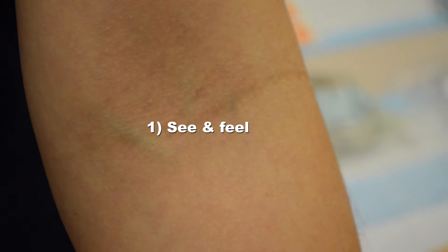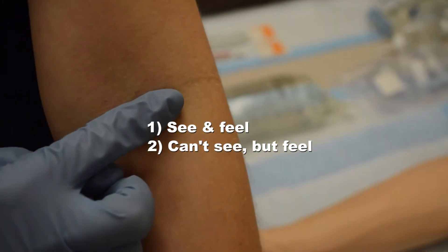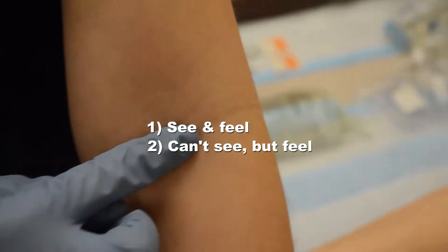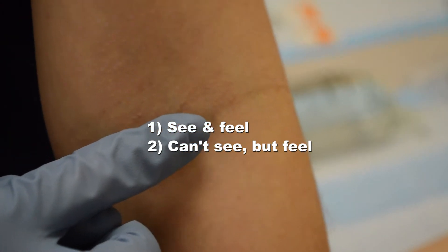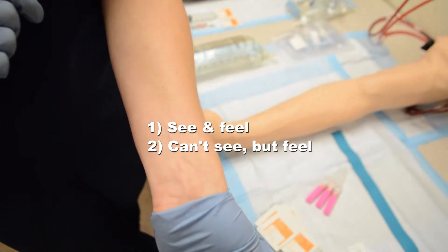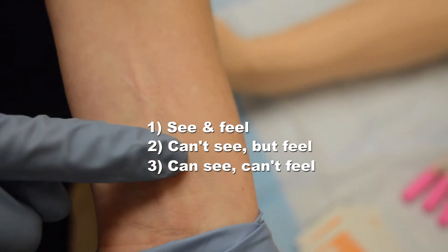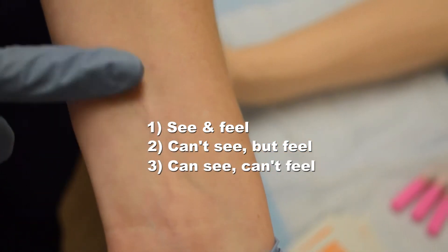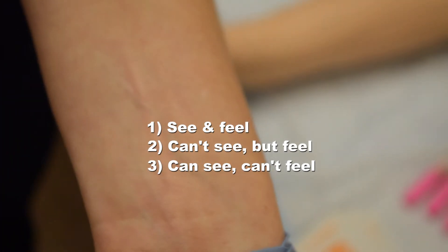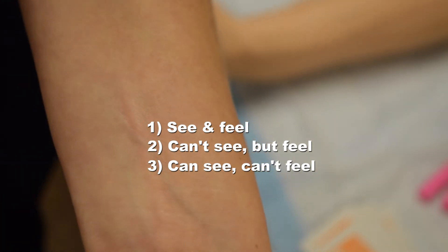Our second choice would be one that we can't see but we can feel. When you start moving across the arm, you start to feel a squish — you can feel that circumference and that bounce back, that squish of the vein. The third type, and our last choice, is one that we can see but not feel. Those tend to be wrist veins or anything in the forearm — kind of a last-ditch effort — and they tend to require a smaller catheter size, such as a 22 or even a 24.